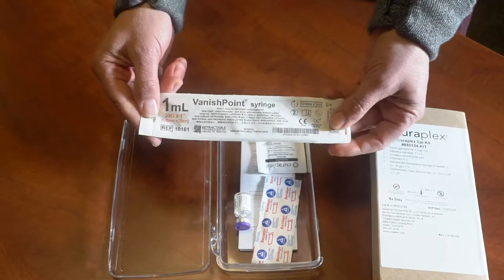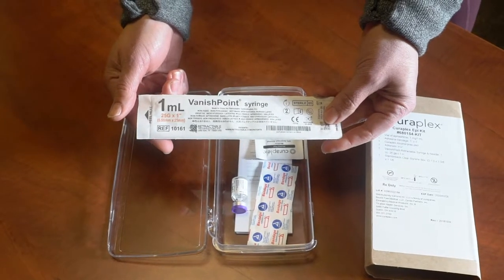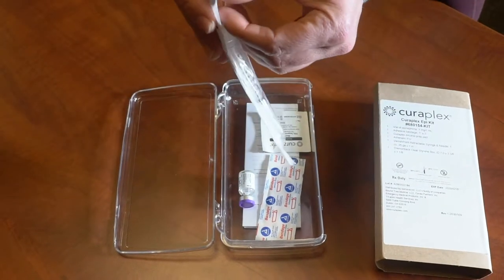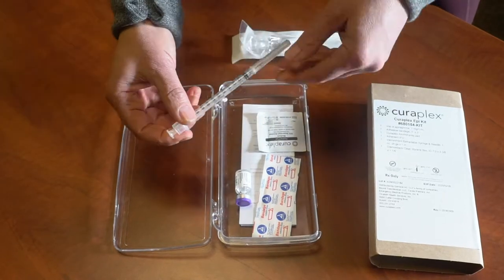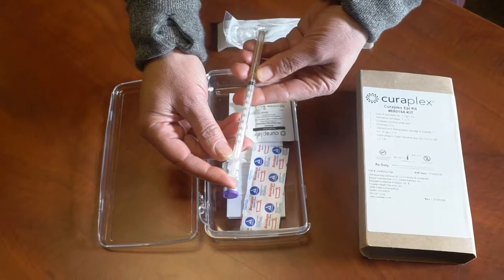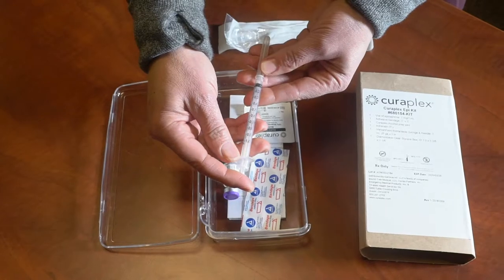The syringe is the biggest change I want to review with you today. It's a generic 1ml syringe with some cool safety features. The FDA has regulated that we can no longer have the letters A for adult and P for pediatric on here. It's now a generic 1ml syringe measured in tenths.